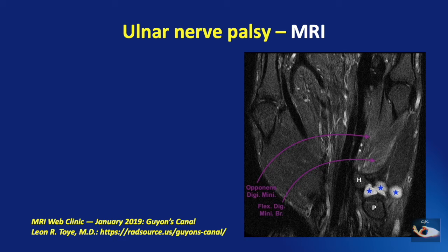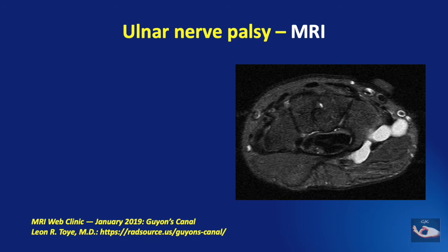You can make out the difference between the texture of the involved muscles and the uninvolved muscles, that is, the abductor digiti minimi and even the thenar muscles. A transverse section confirms the images of the ganglia and shows clearly the point where the ganglia are pressing on the branches of the ulnar nerve, especially the deep branch.